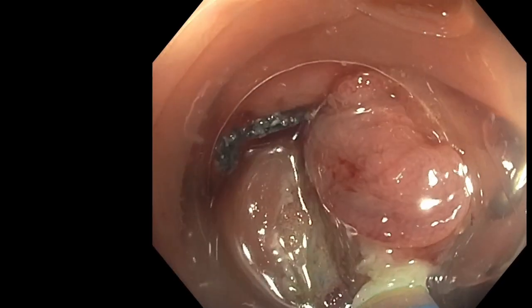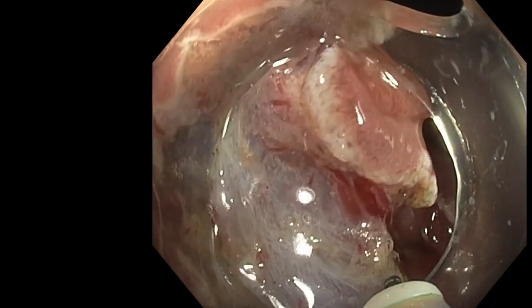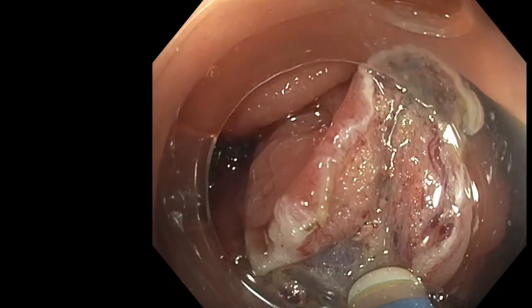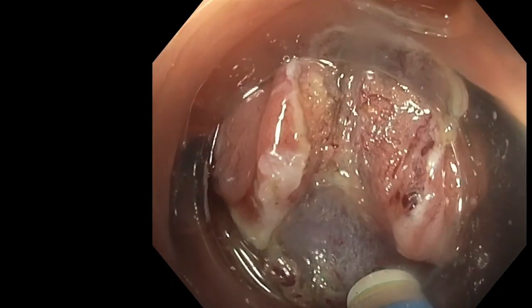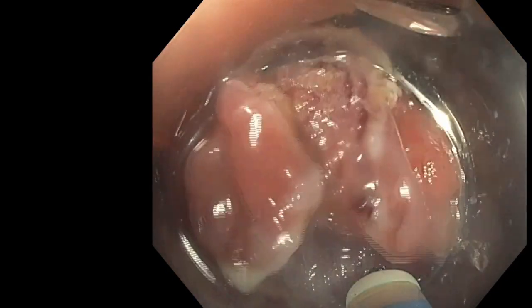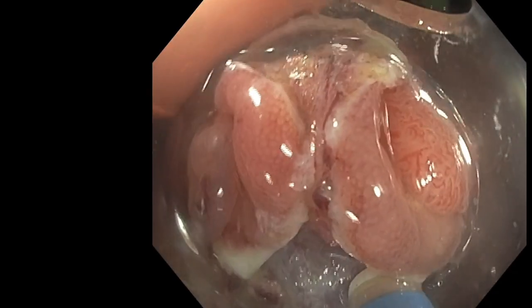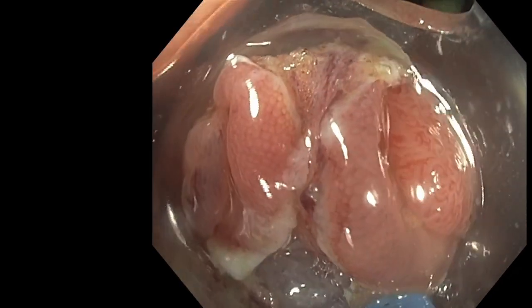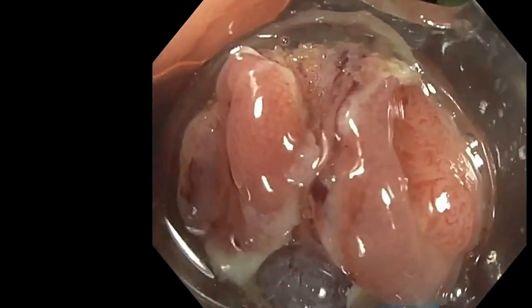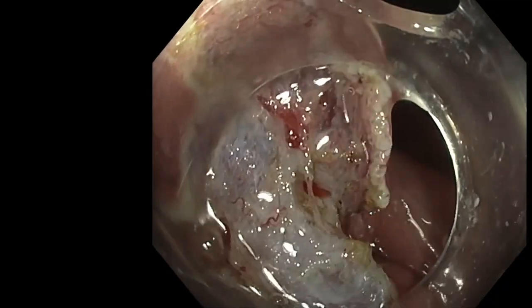We probably have a lot of fibrosis around this diverticula, so it's usual to have a space which is relatively narrow compared to conventional colonic ESD. And we will find the layer, and you will see, thanks to traction, the area will open, and it will be even easier with time. I mean, once the initial dissection is done, the space is increasing and the stability of the scope will become better also, and finally it will be easier to cut and to see the good exposure.